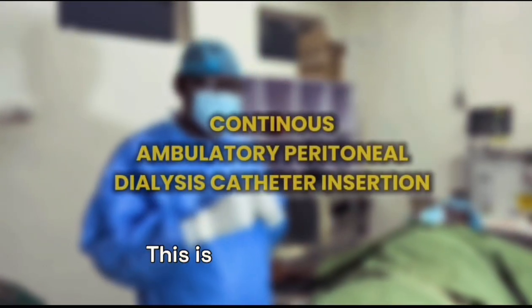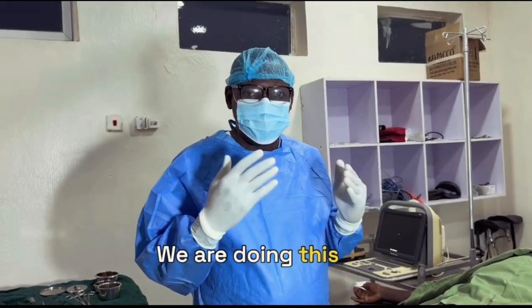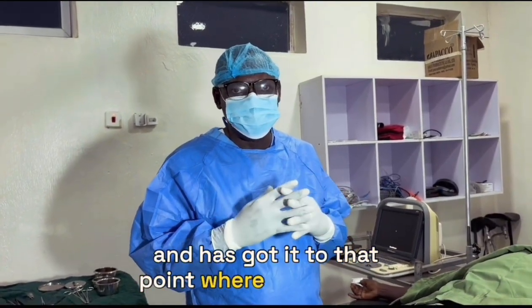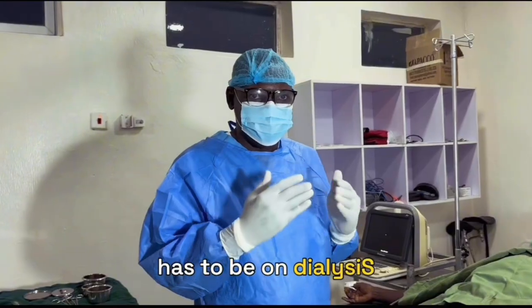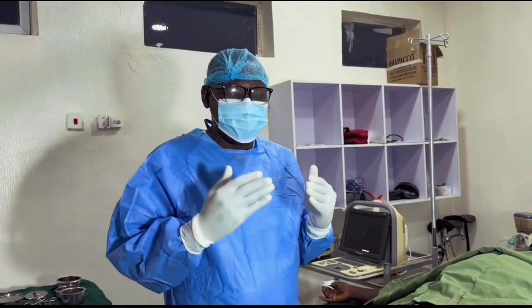This is another session of peritoneal catheter insertion. We are doing this for a patient who has CKD 5 and has gotten to that point where this patient has to be on dialysis. Okay, so I'm going to demonstrate shortly PD catheter insertion.